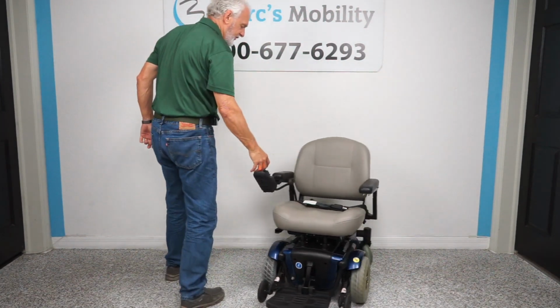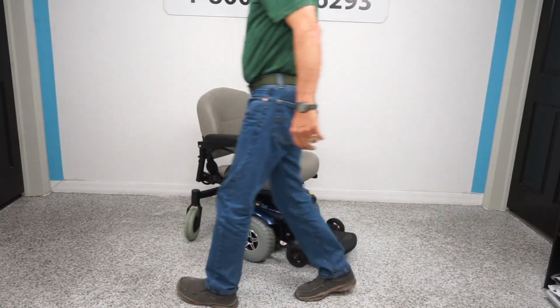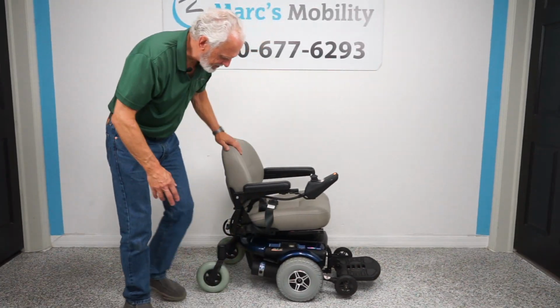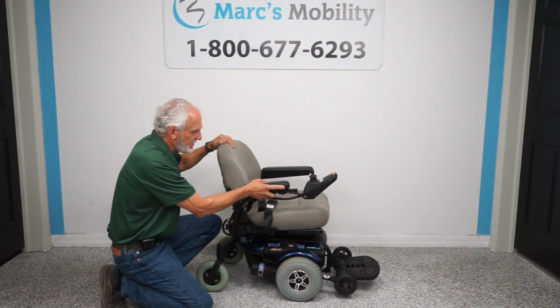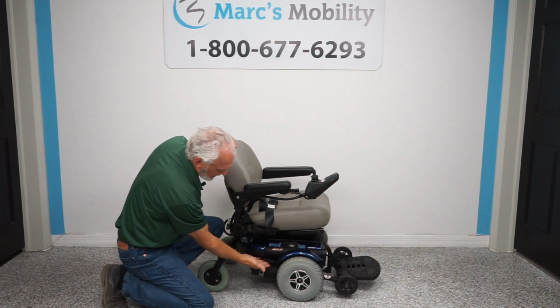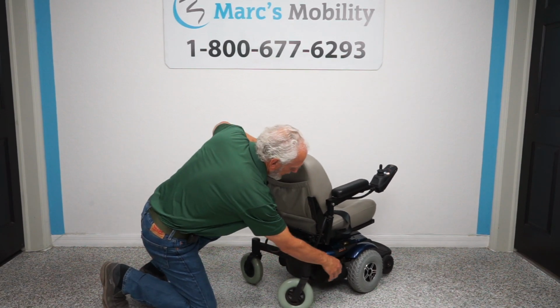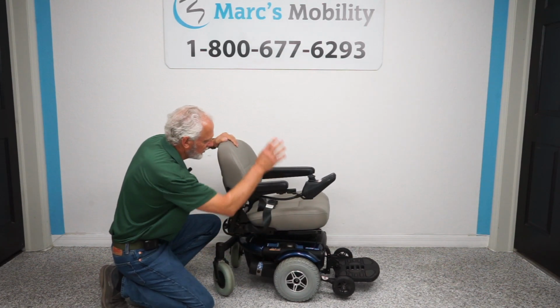Here's the turning radius I was telling you about in your house. And what's so good about this chair is the small turning radius. Also, the motors in this chair are very, very dependable. If I want to push this chair right here like this, I would turn the power off. There's a lever right here. You pull it out like this. You can see the lever is out, and then in, then you're back in gear. Out, you're in neutral.